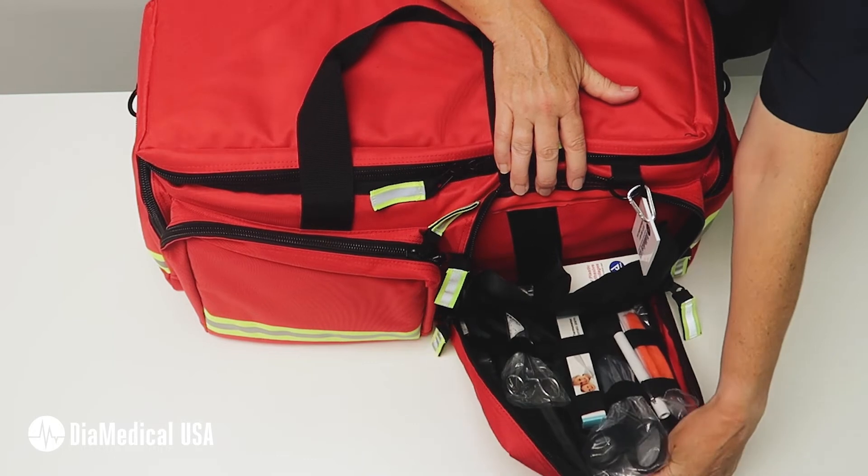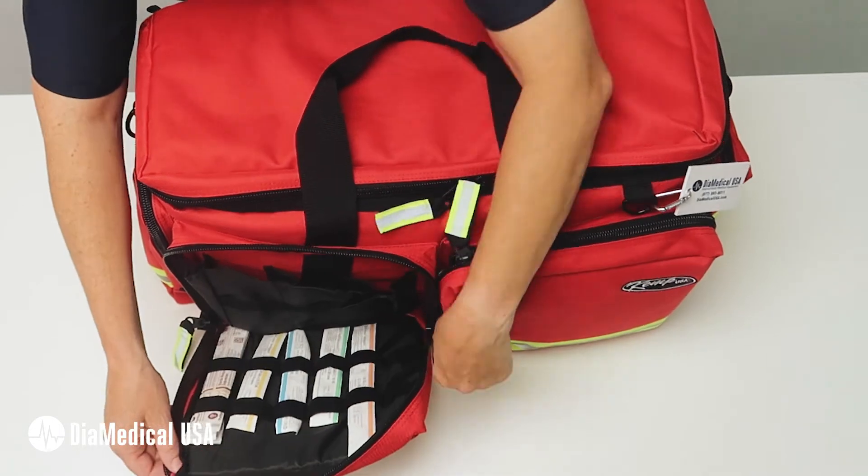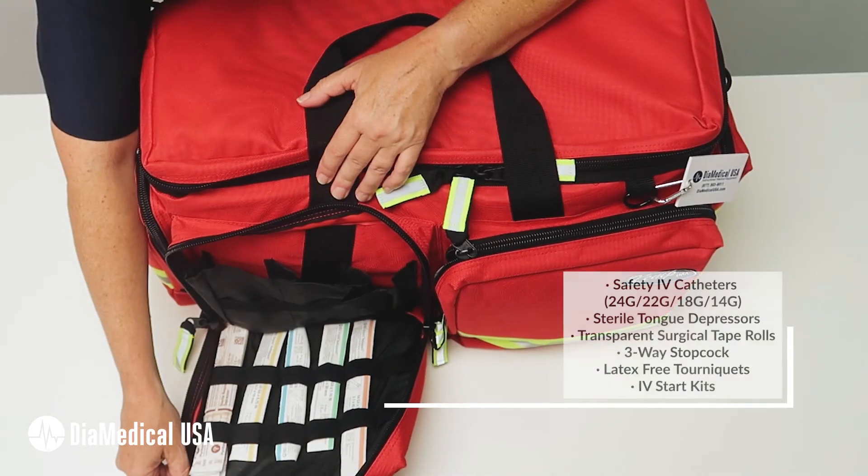The right front pocket contains pocket instruments for patient assessment and first aid. The left front pocket has IV supplies with a row of elastic retainer bands so that you can see the various sizes of safety angiocatheters.